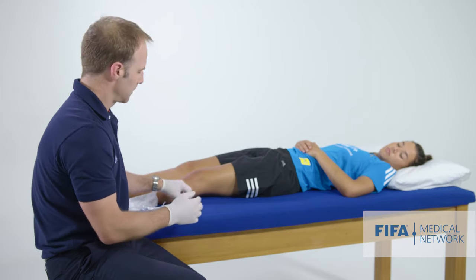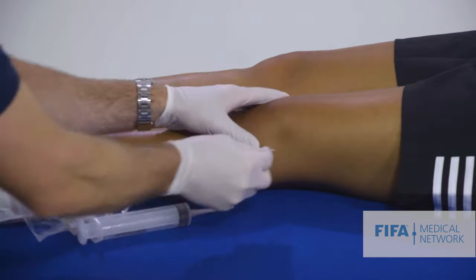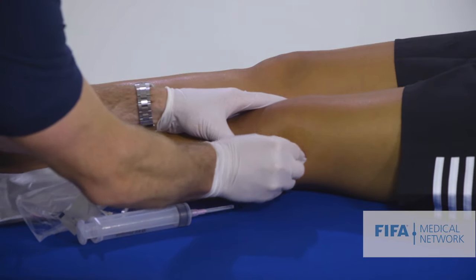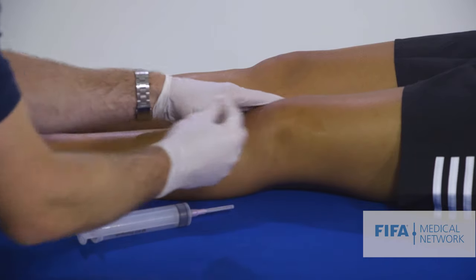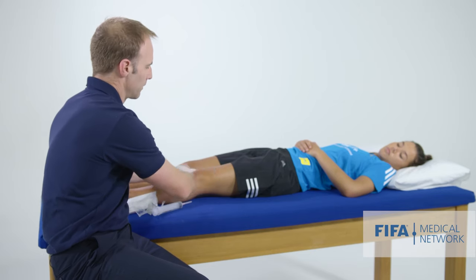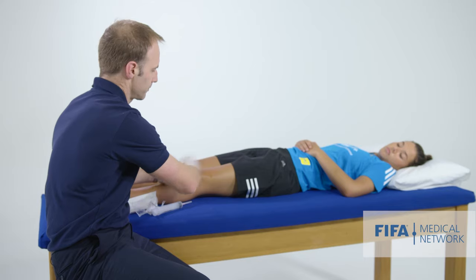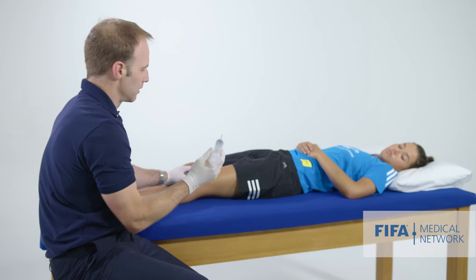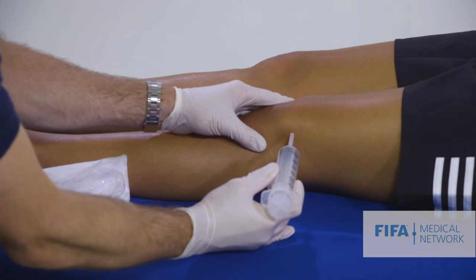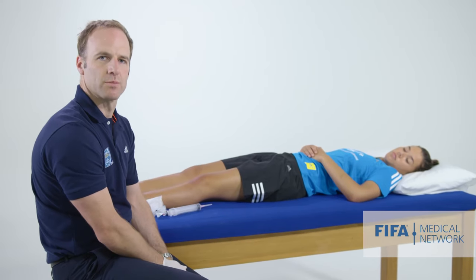I use sterile gloves and clean the area with an alcohol swab — no drapes are needed. When using alcohol swabs, it's important to wait for the area to dry properly, as it's not sterile until the skin has dried. Then, using the large needle and tilting the patella, I insert the needle underneath the patella and slowly aspirate the fluid. This can make a massive difference to the patient's symptoms.